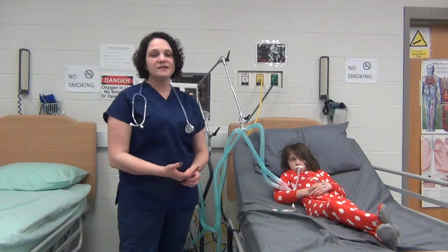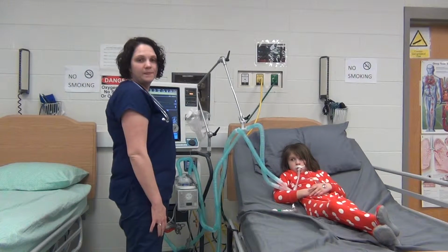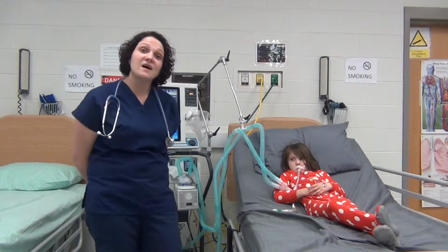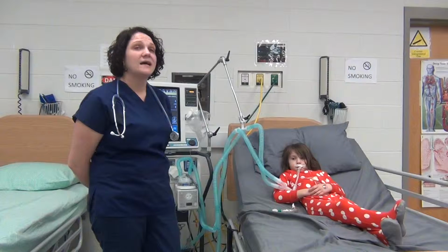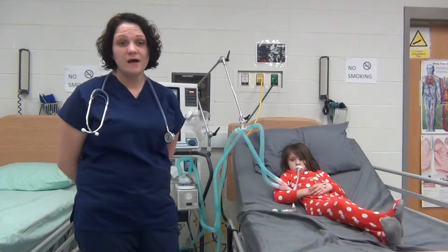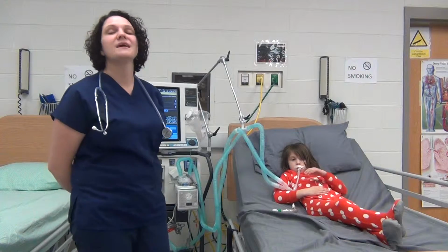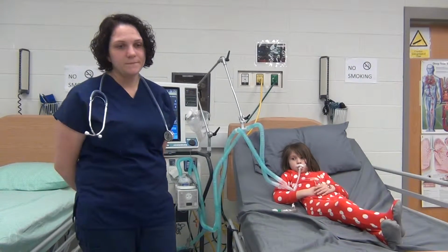Special precautions I will need to consider as I'm weaning my patient to the minimal ventilator assistance during the weaning phase is that this disease process causes high lung compliance and high airway resistance, which leads to air trapping. So I need to make sure as I'm weaning her, I'm giving her plenty of time to exhale. So I need to make sure she has extended expiratory time and attempts to prevent auto PEEP and air trapping.